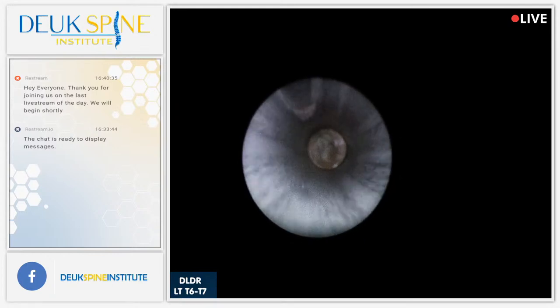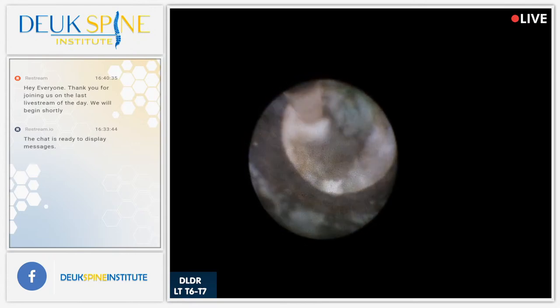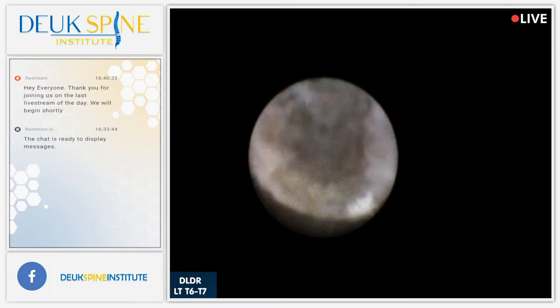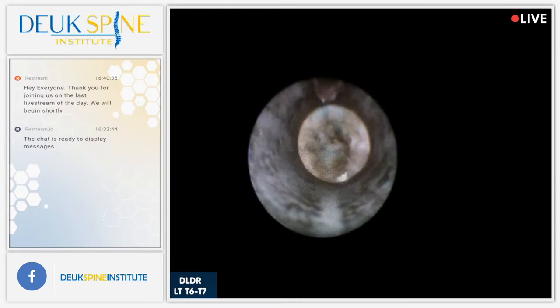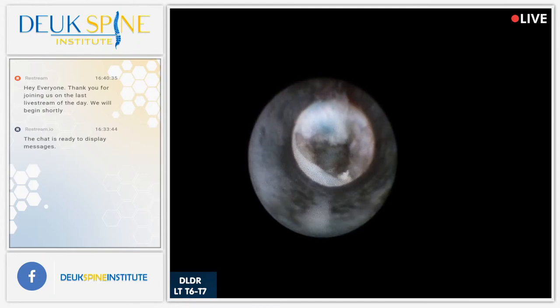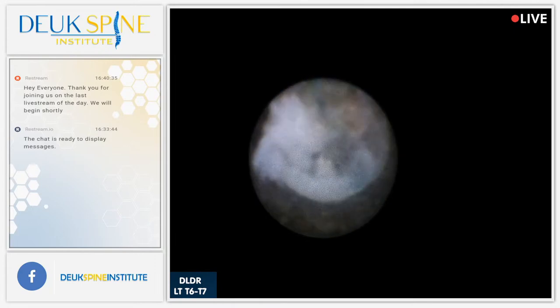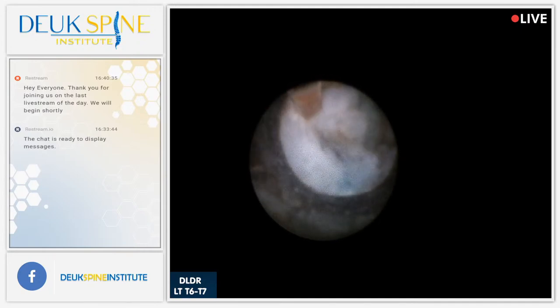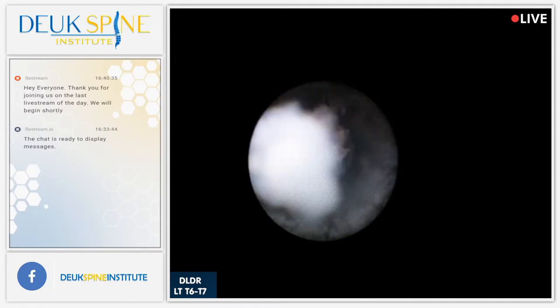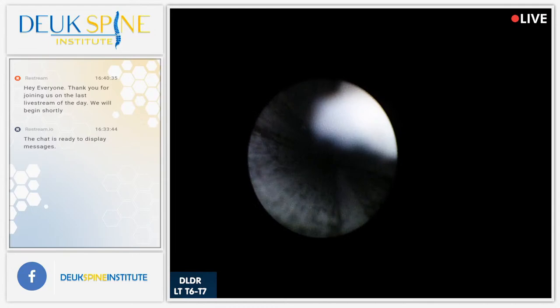So how's the irrigation? Good? Jordan, irrigation is fine there. All right. So here we are. We're going to fix her thoracic problem with one surgery, and this should last the rest of her life. Just about done. See the herniation? Every time I pull the tube back a little bit, you get to see a little more of it. And remember, the laser fiber you're seeing down there is 1 millimeter wide. So it gives you an idea of just how small of a space we're working in.